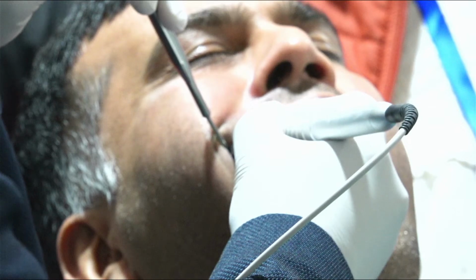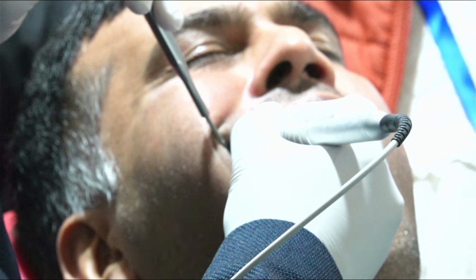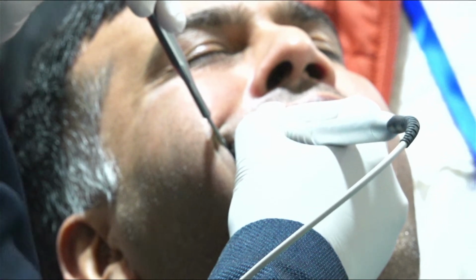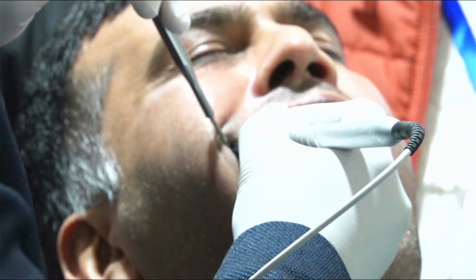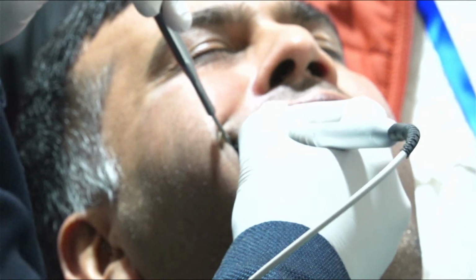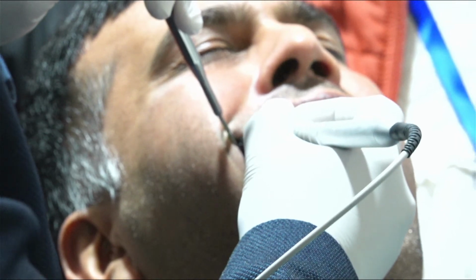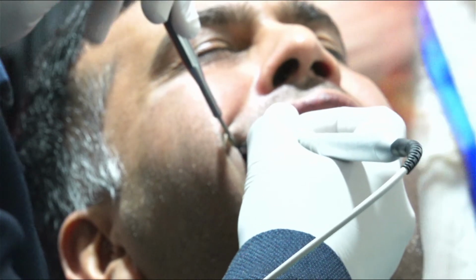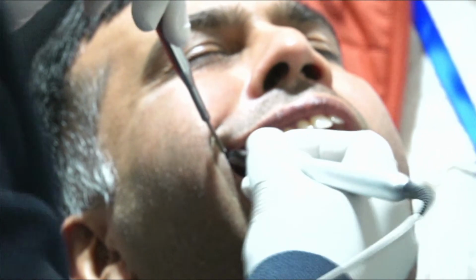It is again what I said, Arndt-Schulz law. If you are in that therapeutic window, I will share that article with you. If you are in the therapeutic window of 2 to 4 minutes, you are going to do no harm. Maximum what can happen, it will have no effect. It doesn't do any harm. It will have no effect if you are delivering the energy constantly. No harm. No effect, no side effect. If you are going for a lengthy period of time, there will be no effect only.